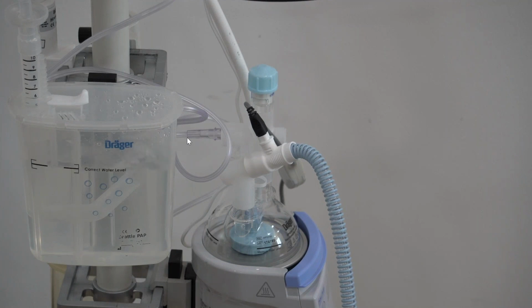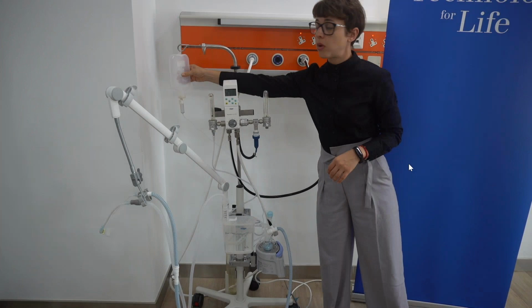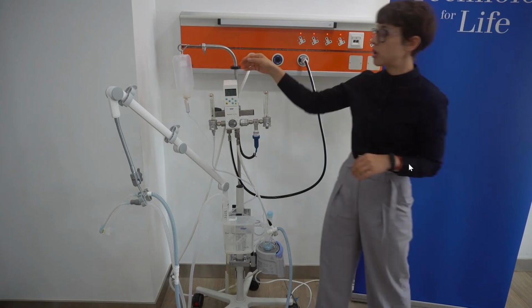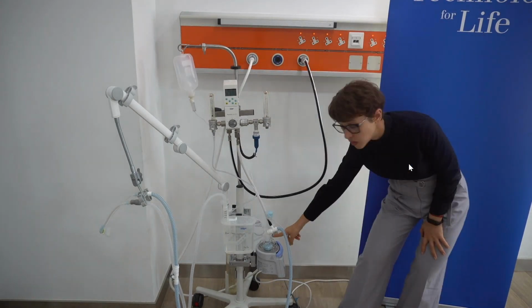Okay, so the next question is: does the bottle hang on the drip stand as part of the CPAP setting? If yes, what is the content in the bottle? It is actually not, and I think that is the question being asked. This bottle in the drip stand is not part of your bubble CPAP solution. This is just the water that goes into the humidifier.